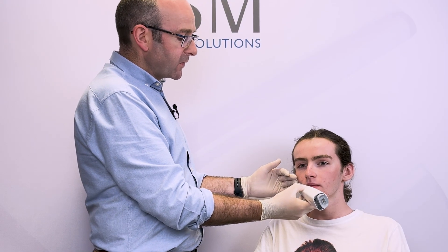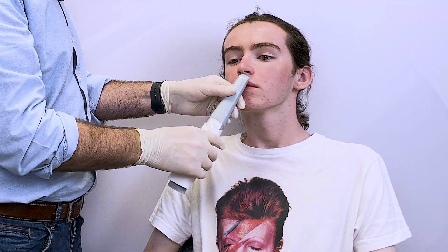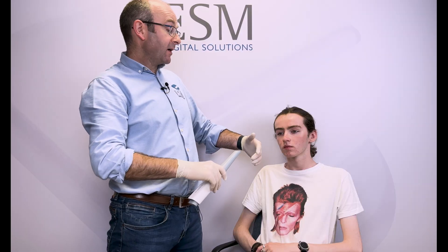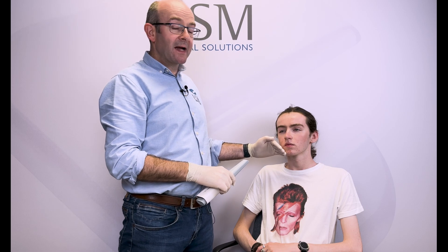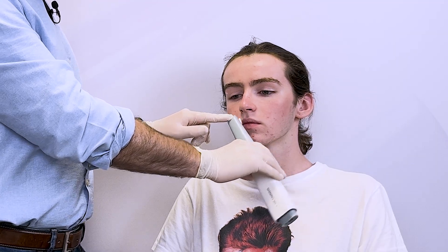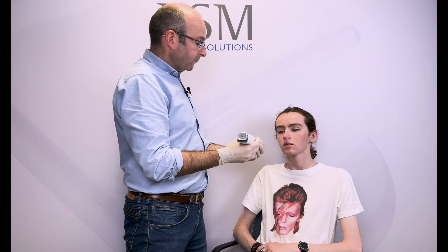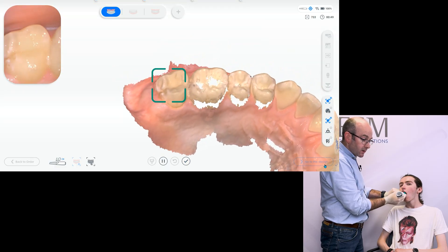The reason I like to do that is it's more comfortable for the scanner and more comfortable for the patient to have the scanner coming out of their mouth on the buccal aspect rather than going back in. If we try to do it in one sweep, we have to turn the scanner around and push back in again, which can be challenging as an operator — the somersault motion can be tricky for the software and a little uncomfortable for the patient. So keep it easy: start at the back, sweep around to the midline, then start at the back on the other side. You'll notice I tip the scanner typically about 45 to 90 degrees, which keeps the lip out of the way.